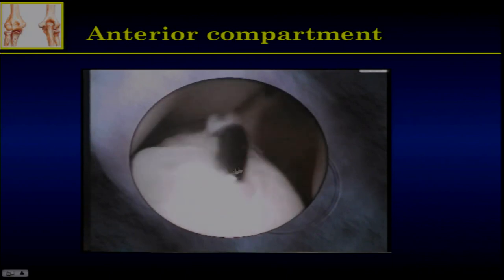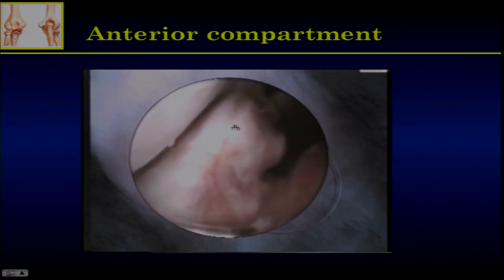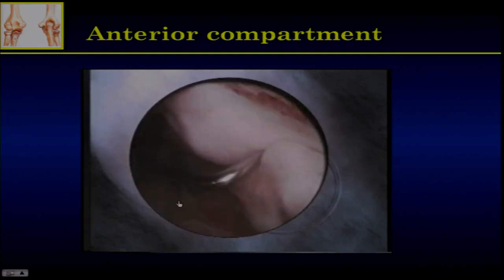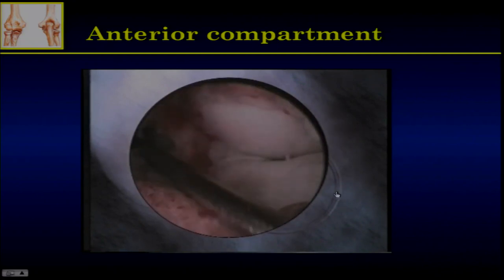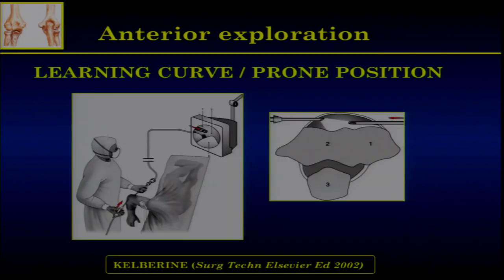The image is black and white — I don't know why. That's the radial head. That's the tip of the coronoid process. The probe comes from the posterior straight portal, and of course you can switch all the portals. You don't have to be fixed in one portal — you can move from one to another. However, in this position there is one challenge in anterior exploration: the screen displays the compartment as if you were in front of the elbow, but in fact you are behind it. It's a learning curve — quite difficult — but little by little you can improve.